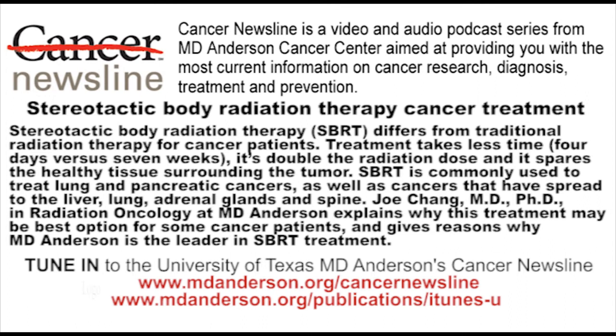And is SBRT used as a frontline treatment in these cases, or is it adjuvant therapy with surgery and/or chemo? It sounds like it's a frontline treatment in many cases. Well, it depends. If it's medically inoperable early stage lung cancer, then SBRT is frontline treatment for sure. For patients with recurrent or metastatic cancer spread to the lung, then systemic treatment, including chemotherapy and biological treatment, will be the mainstream treatment. But radiation therapy using stereotactic function as the boost to the local area.